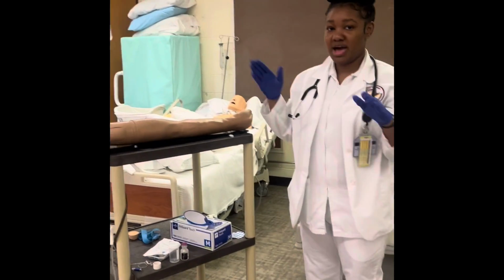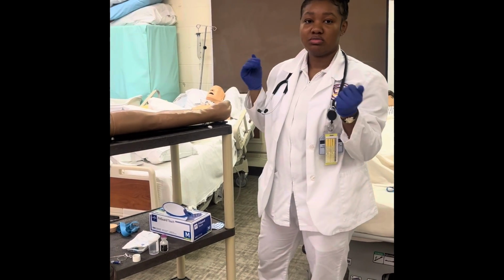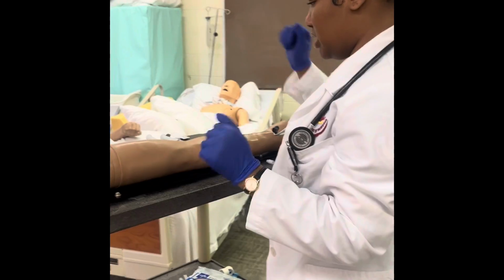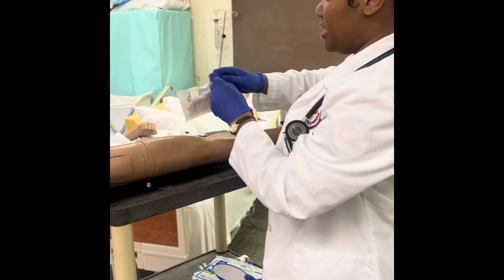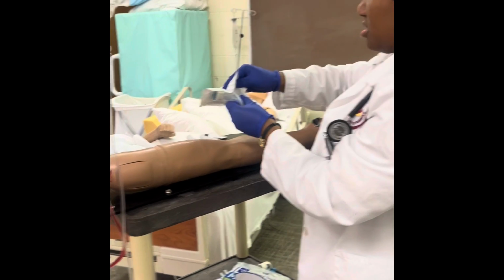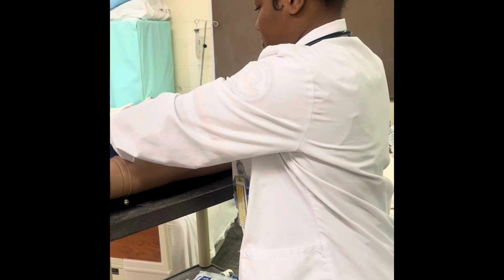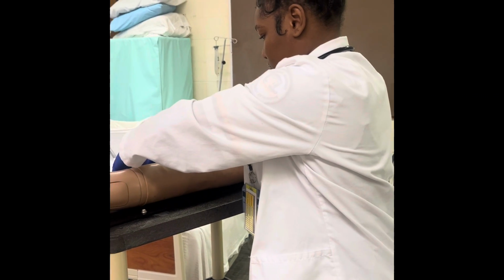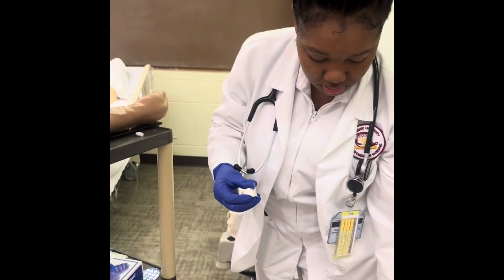Okay, now I'm gonna start my IV if I haven't already, or if I need to wash my hands, put on some clean gloves. So before I begin, I can go ahead and get my station set up, open up my IV kit, and prepare all my equipment.